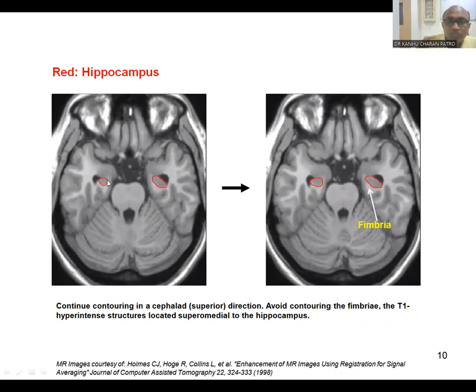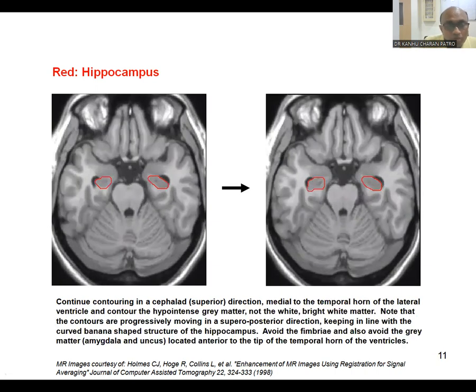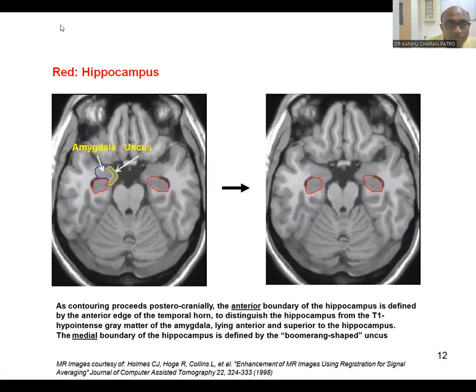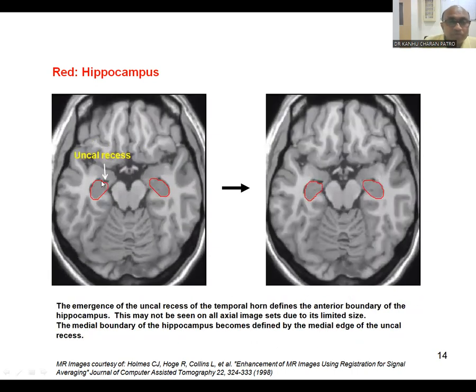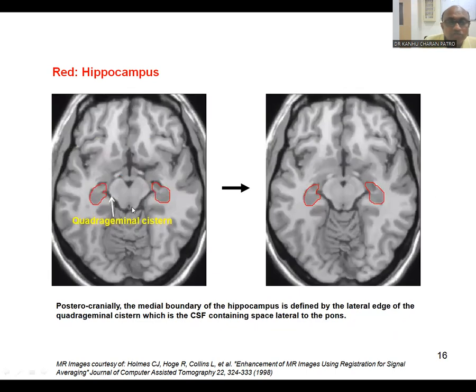Start from the temporal horn; the posteromedial part should be contoured. Go superiorly, and anteriorly the amygdala should not be contoured. Continue going up until you reach what is called the quadrigeminal cistern. When the quadrigeminal cistern finishes, your contour finishes.